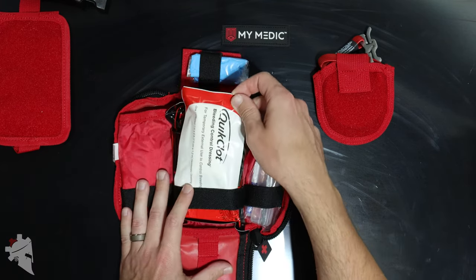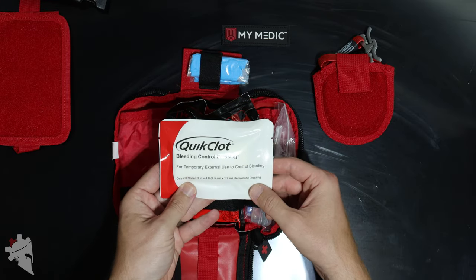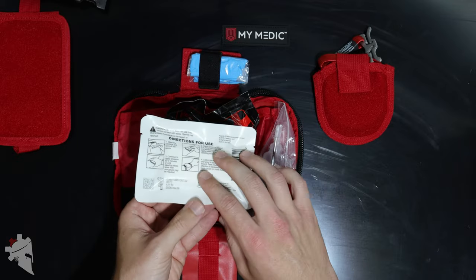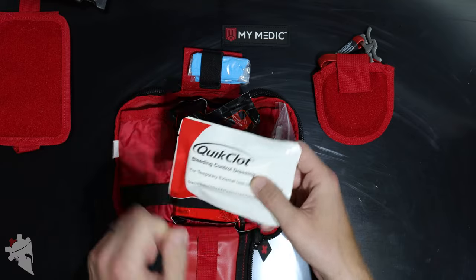First thing you'll see is a bleeding control dressing from QuickClot. This is a hemostatic dressing, which means the dressing itself will actually promote clotting of blood as soon as you apply it.